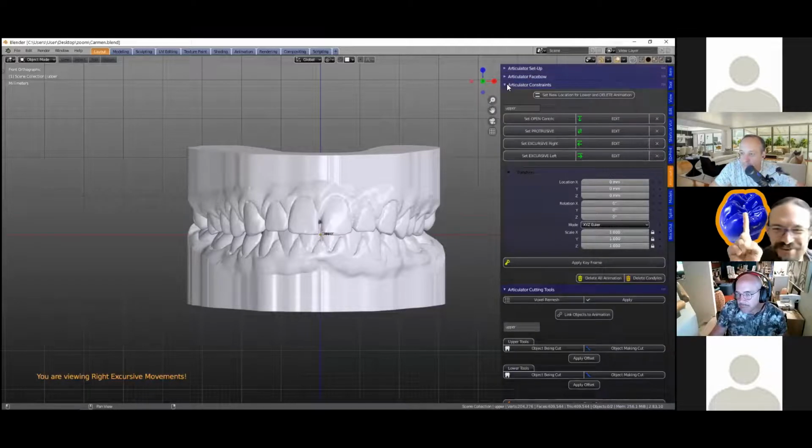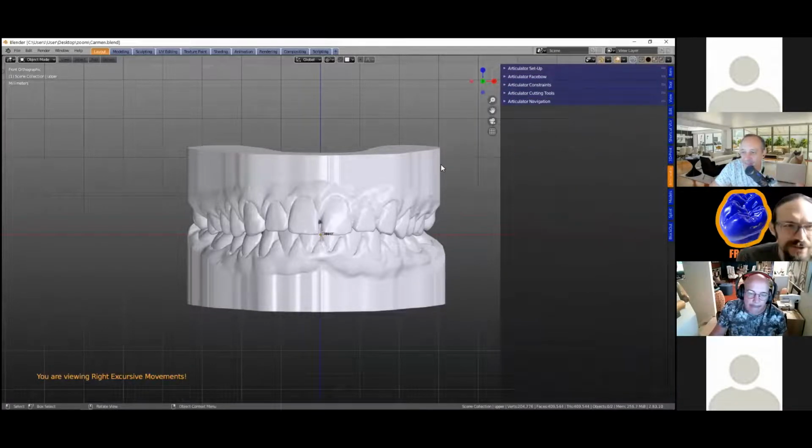I only have one question. When you were doing animation, you have five keyframes. And when you do cutting of all the movement, you have like 13 cuts. But if we do more keyframes for an animation, does your algorithm cut all the keyframes we do, or do you only do 5 keyframes for a specific motion? No, it'll cut number one only once, and then it'll go forward. So it'll jump to number two, 3.